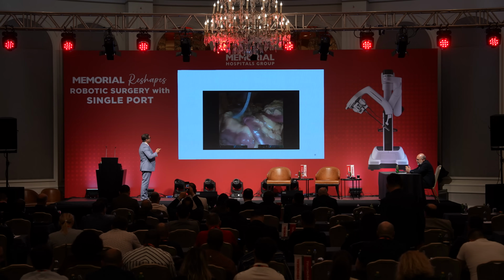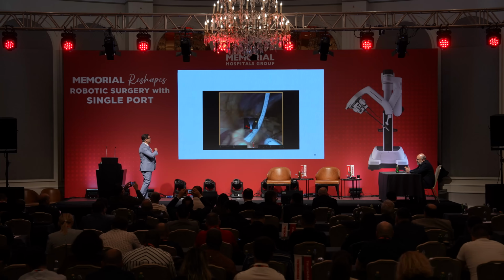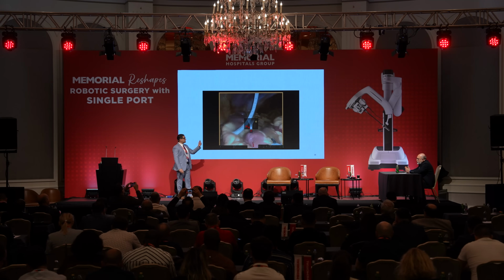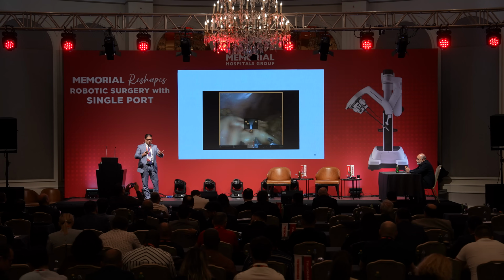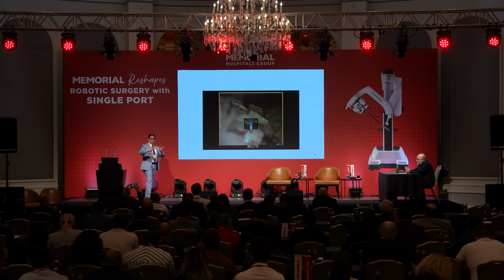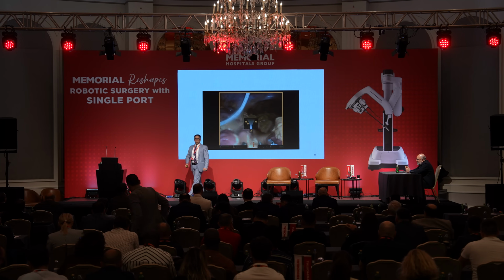Now, this is my view when I was doing that cadaveric course. This is what I was seeing, and you can see what's the mistake here. I see only the tip of the scissors. I don't see the other tips. So now I'm demonstrating what can go wrong, because this is what we need to learn and teach each other. What you do wrong and what I can avoid in my next experience, and vice versa. So you need to see, and that avatar shows you what's going on.